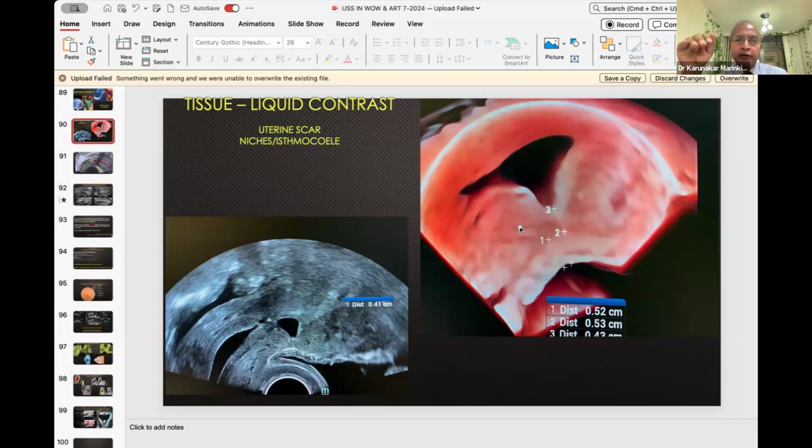But if you do see this at the time of collection, I have an 18 case series from IVF in Dubai, where you can do uterine massage, or even during egg collection, a lot of uterine cavity fluid gets expelled because myometrial contractions are very strong during egg collection because of the irritation we are causing. Occasionally what I did, I put the probe in the anterior fornix and squeeze the uterus to cause expulsive contractions to expel the mucus at the time of egg collection. Of course, I check it again and make sure it's not there. But otherwise, it's very tedious once you give progesterone. Once there is progesterone, you cannot remove uterine cavity fluid. Obviously, if there is this, electively, you can just burn the floor of the pit.